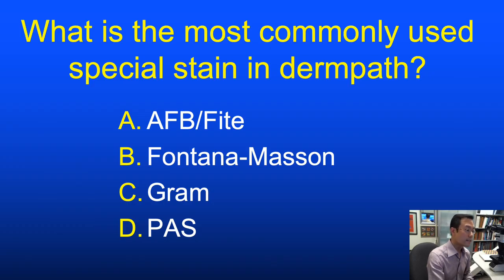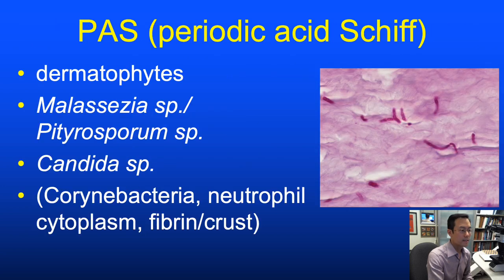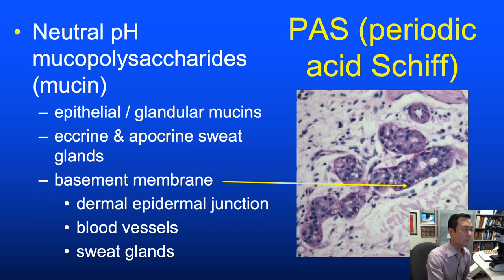After H&E, the second most popular histochemical stain in DermPath is likely the PAS stain. It is a workhorse for identifying dermatophytes and superficial fungi such as Malassezia or Candida species, and will also identify some bacteria, neutrophil cytoplasm, fibrin, crust, and neutral pH mucopolysaccharides or mucins.